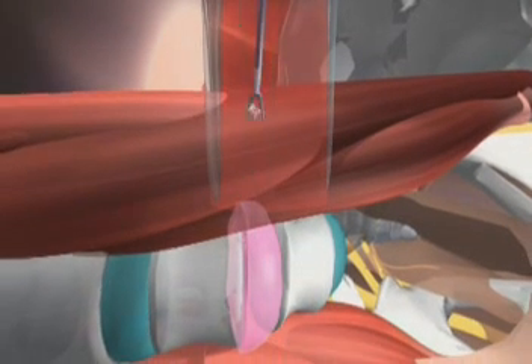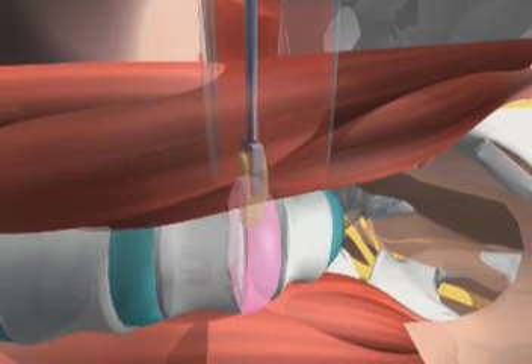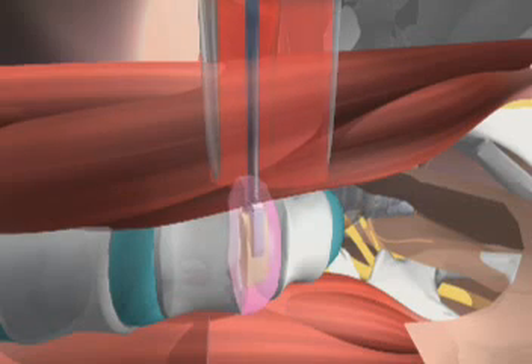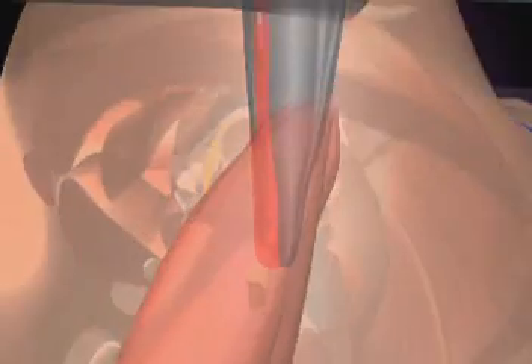With the intervertebral disc now visible and accessible, the surgeon removes the intervertebral disc and prepares the disc space for fusion. With the disc space prepared, the surgeon then places a large stabilizing implant into the empty disc space to restore the proper disc height and to support the loads put on that spinal segment.